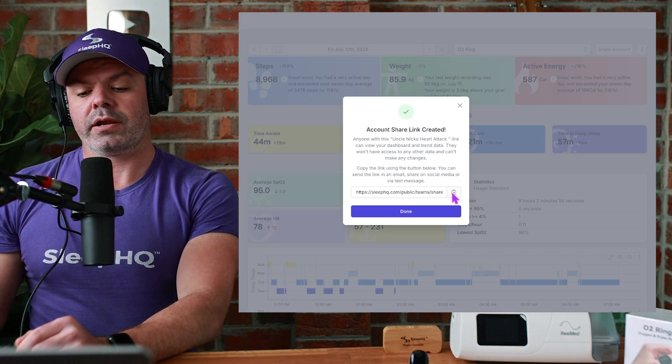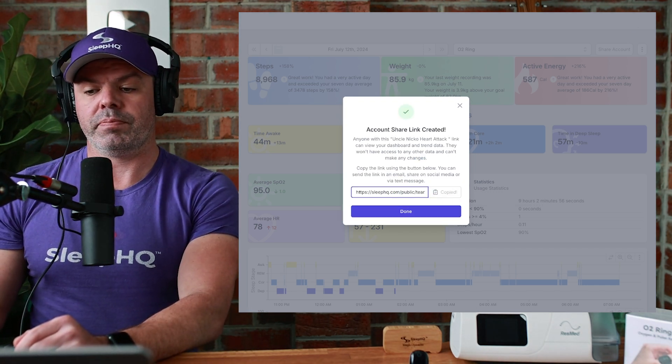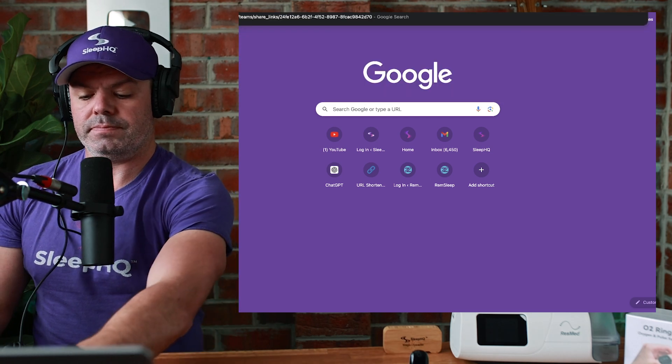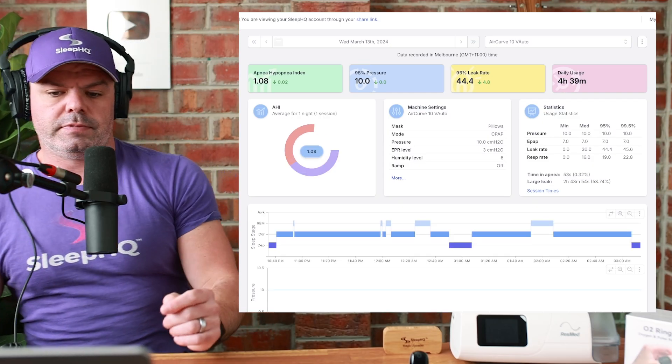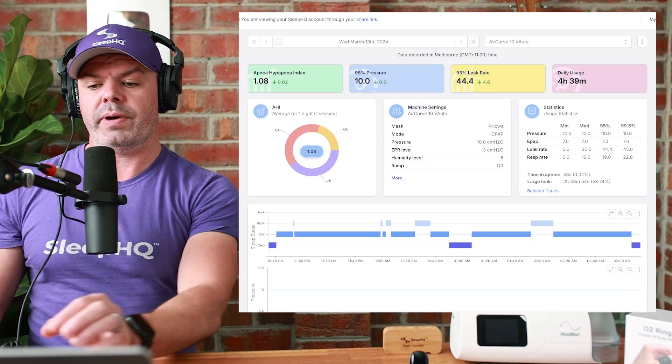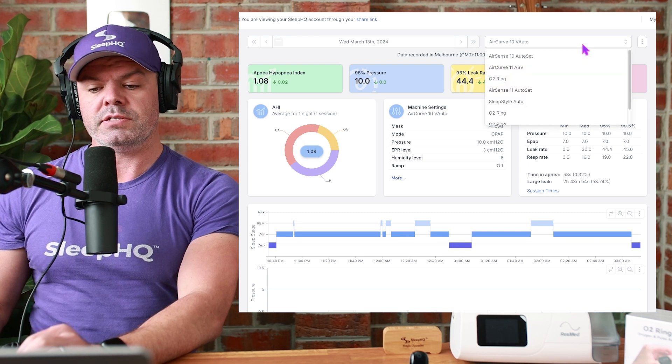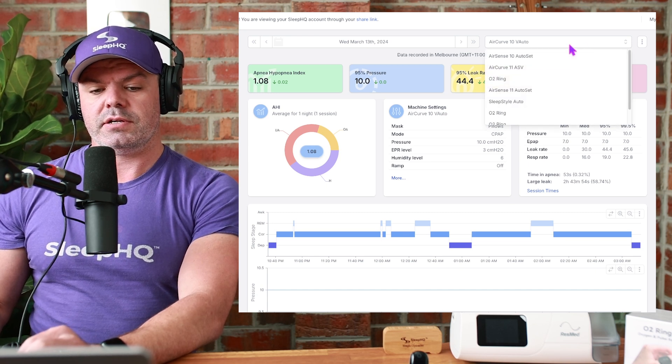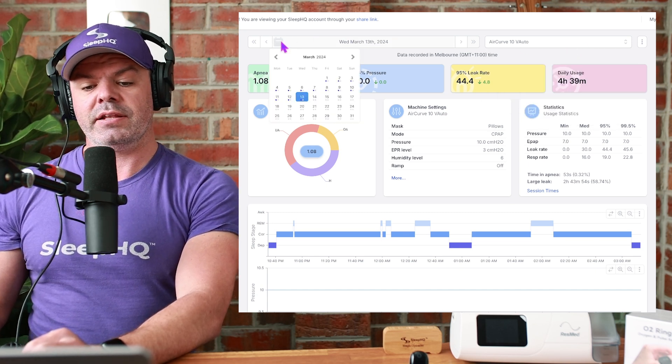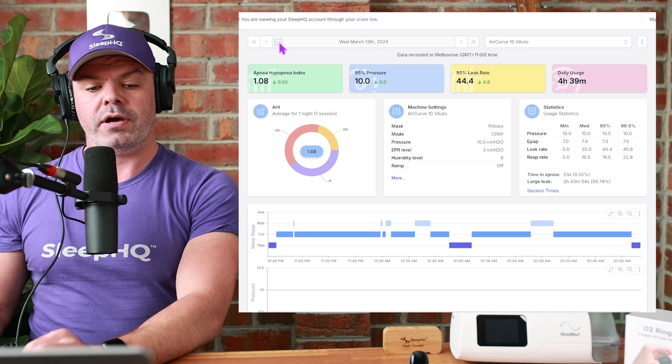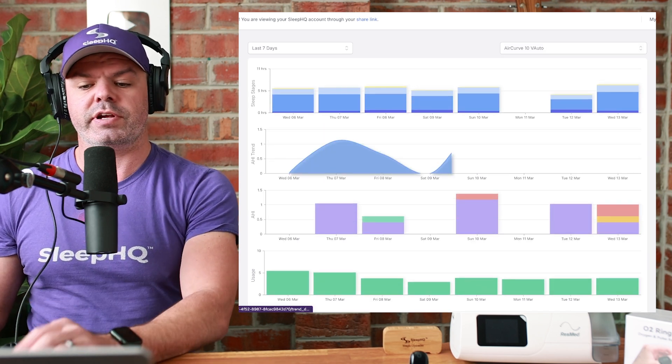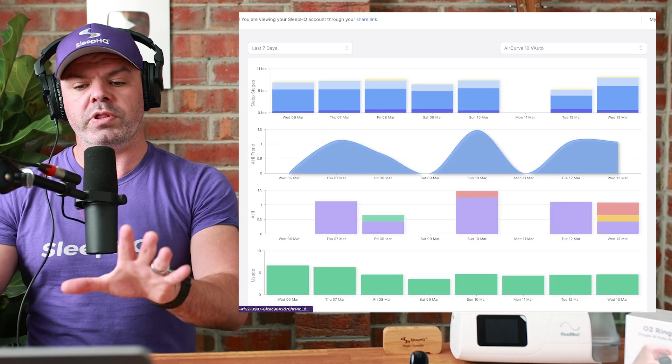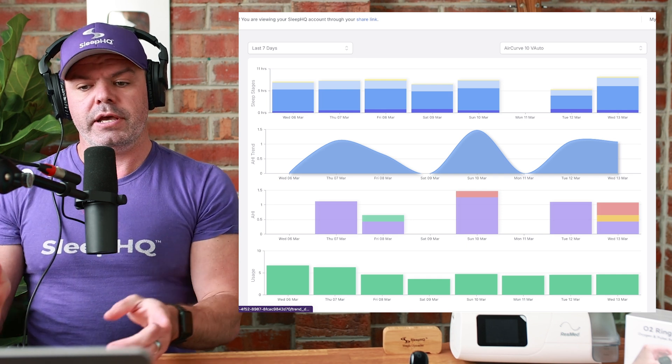Create account share link. Now, I can copy this share link and I'll paste it into a browser. And just like before, no personal information. But look, now I can switch devices. I can access the calendar. Choose a different day if I want. I can come over here to the trend data. Check out the data trends. All the charts. All the information. Anonymous.